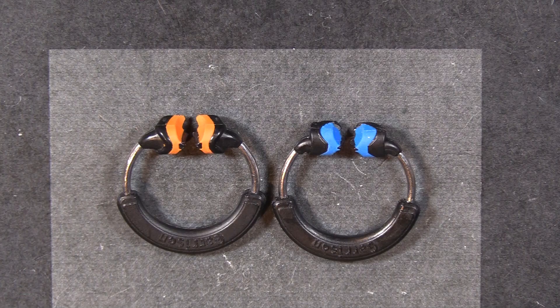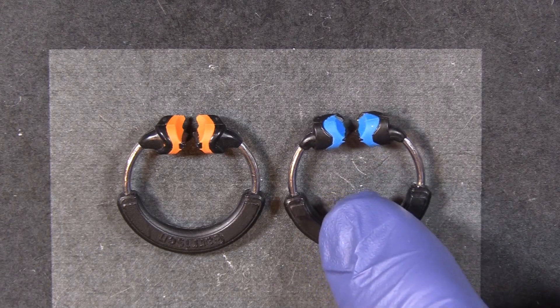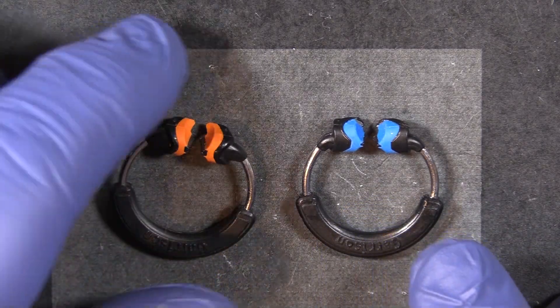Hi everyone, this is Kevin with Garrison Dental Solutions. Today we're going to take a look at the ring on the right, the 3D XR. The XR stands for extra retention. It is a descendant of the orange ring, the 3D 500.